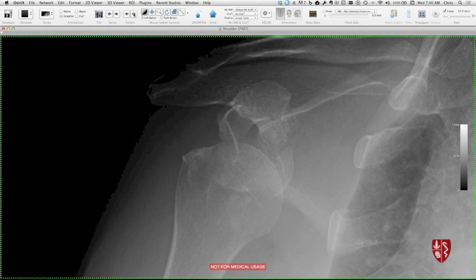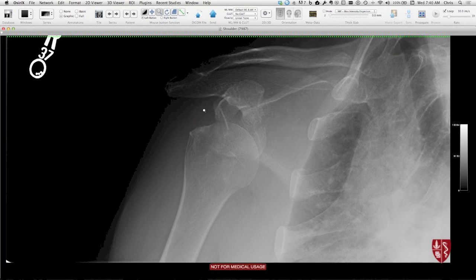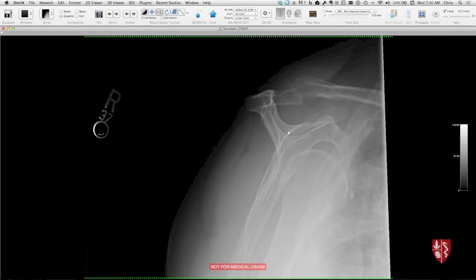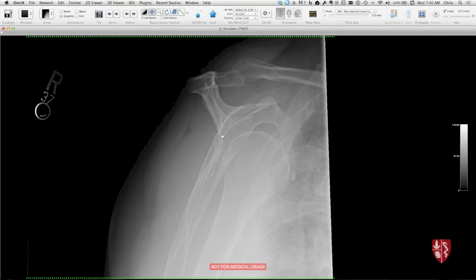Kind of a similar case here, different patient. This is another anterior inferior type of dislocation. It's hard to see the glenoid in this patient. You can see that the humeral head is lower than this part of the glenoid here. And so here's a Y view — glenoid's in here, humeral head's inferior.